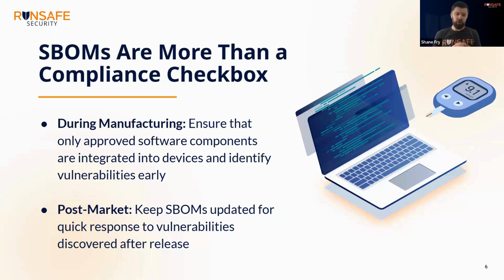And that's where kind of the post market part of this really comes in, because these devices are going to be long lived. I don't know many hospitals that are buying CT scanners every year because they're breaking. Like they're going to be there for a long time. A lot of the devices that are implantables and wearables, like those are long lived devices. So we've got to make sure we keep those up to date and keep tracking the vulnerabilities against those SBOMs for things that we've shipped.